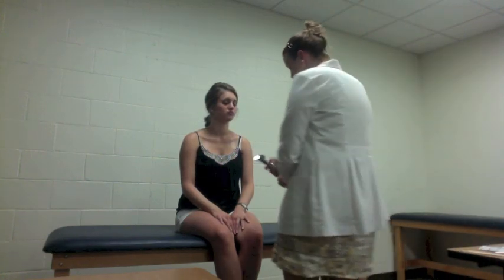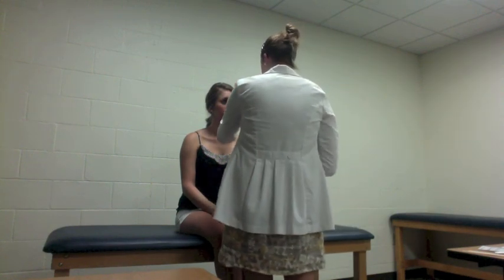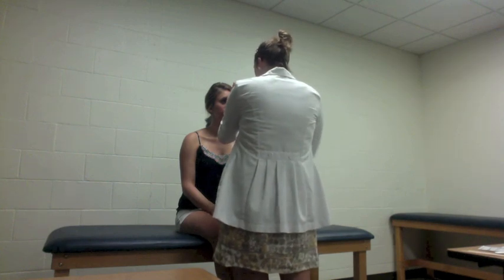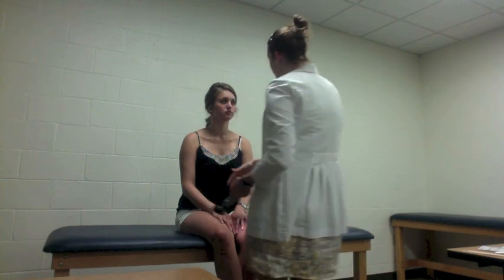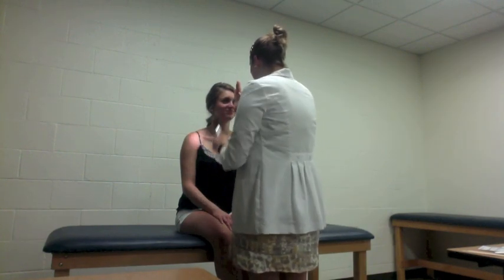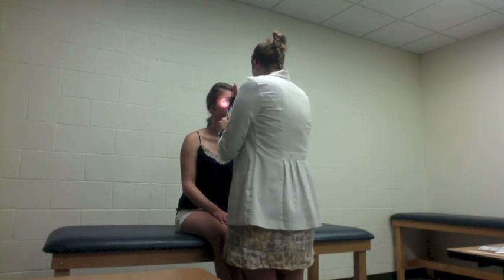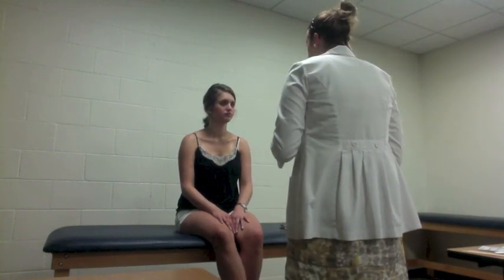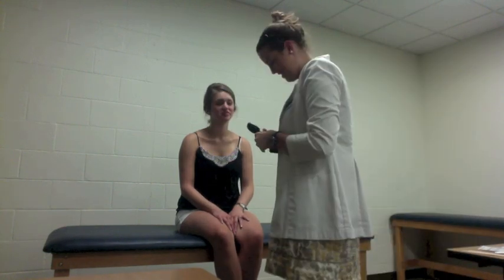So now I am going to test if your pupils constrict or not, which is normal. I'm going to place my hand here, and you just keep looking at me. I'm going to shine a bright light in your eye. Okay, your pupil constricts. Now I'm going to look at your other pupil, and that also constricts, which is normal. We're going to do the same for this eye. Ready? Okay, that constricts. Now I'm going to look at the other pupil. Very good. Now that I've tested your eyes, I'm going to look in, and I can visualize your optic disc and your macula.